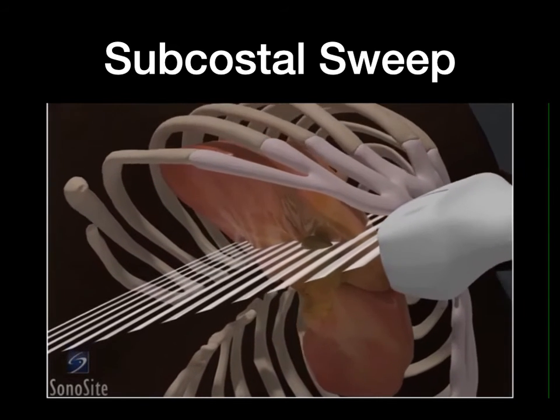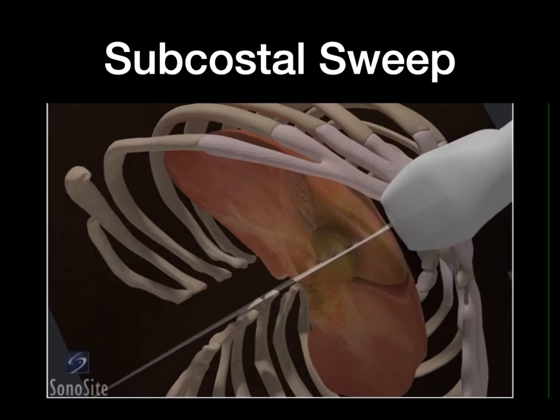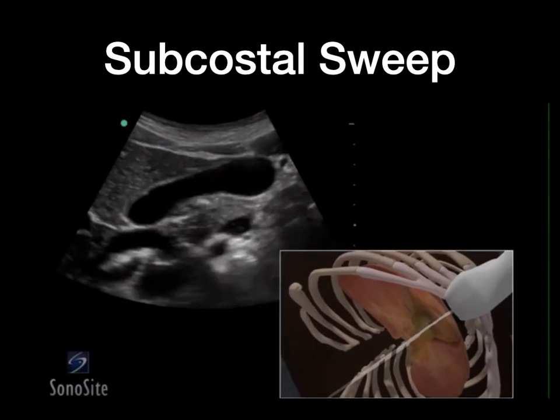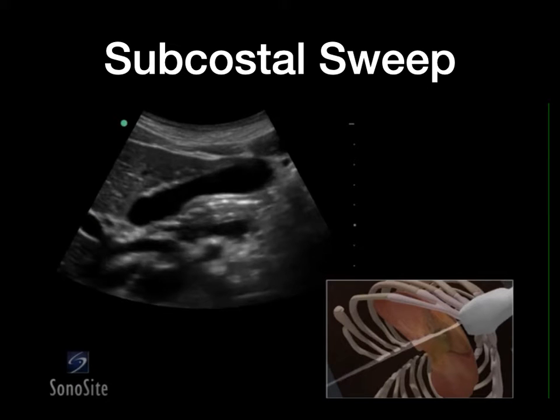Here is just a clip of their biliary how-to video using the subcostal sweep. They start in the epigastrium or just right of the epigastrium with the curvilinear probe in the longitudinal and then begin fanning laterally or rightward. Sweep fully through the liver parenchyma, noting the vasculature. Keep an eye out for hypo or anechoic sac-like structure.